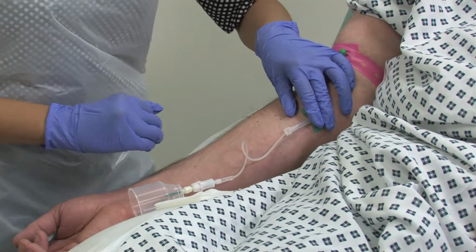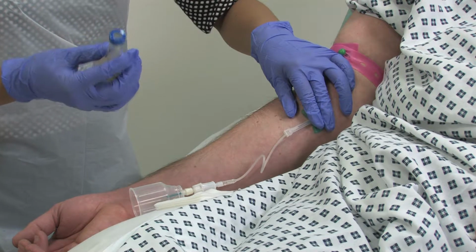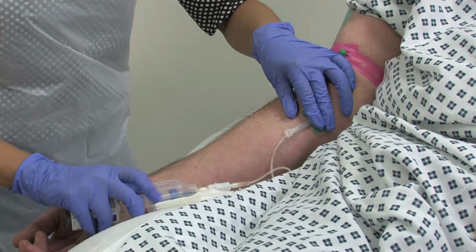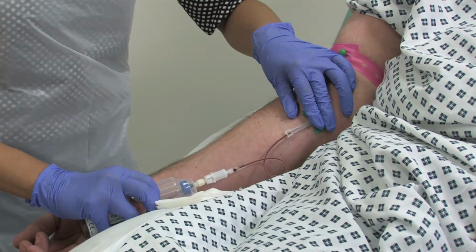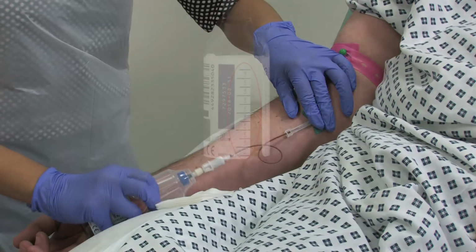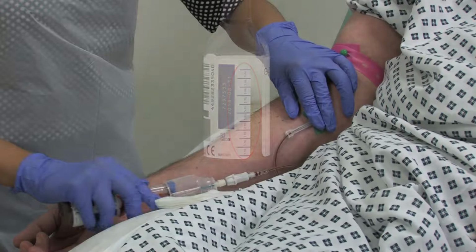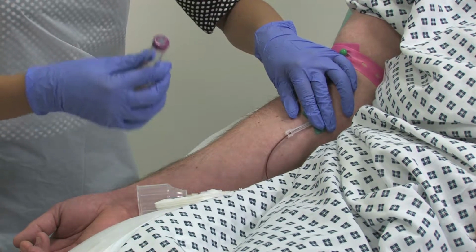Once a flashback is seen, we can collect our blood cultures. It's important to start off with the aerobic, the blue top bottle first. We should fill our bottles up between 8 to 10 mls, and we are guided by the labels on the bottles. We should repeat the same process with the anaerobic, the purple top bottle.